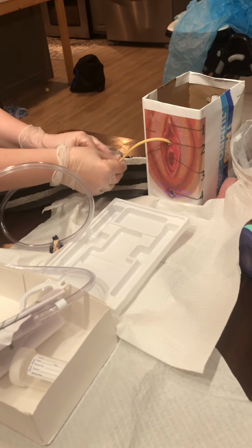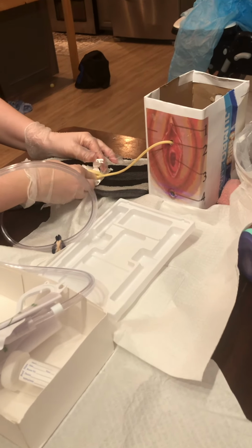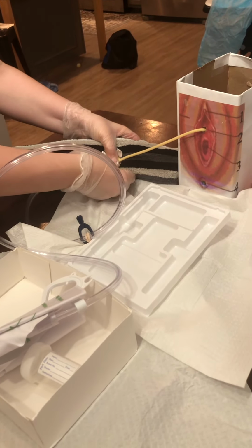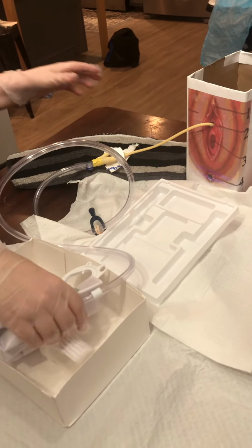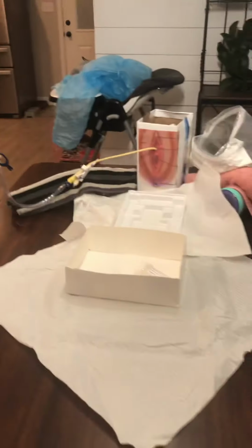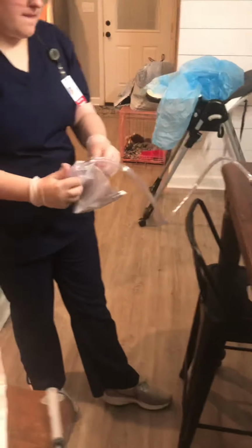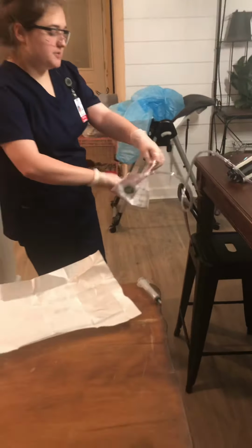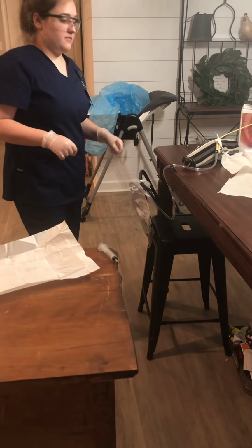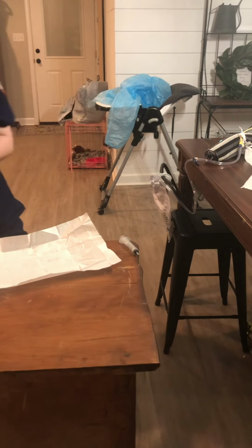And I'm gonna make sure there's not any tension with the catheter. I'm gonna close my stat lock. And then I would hang my drainage bag on the bed frame and make sure that there's no dependent loops in there. But for today, you know, it's not an adequate environment. So now I'm gonna get a towel.